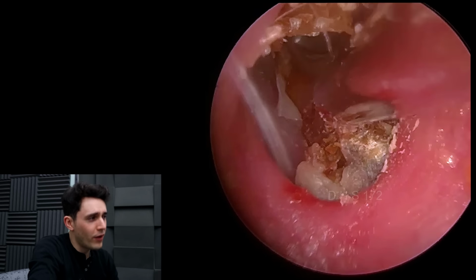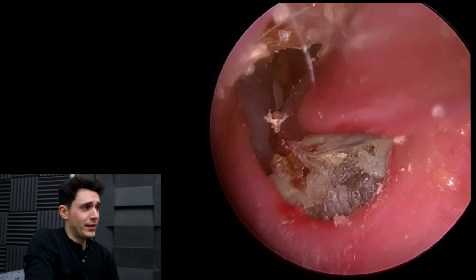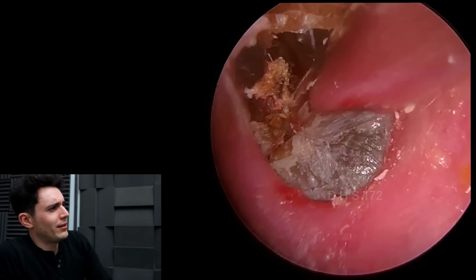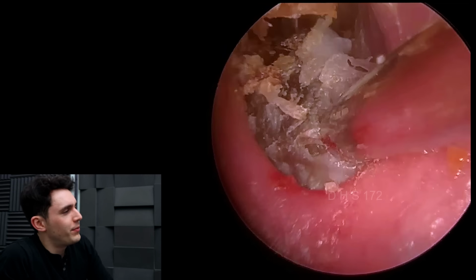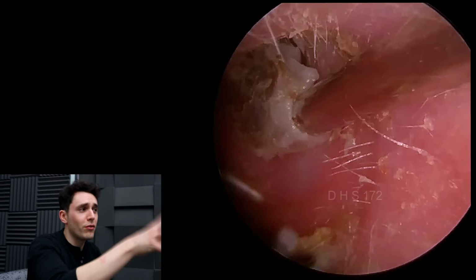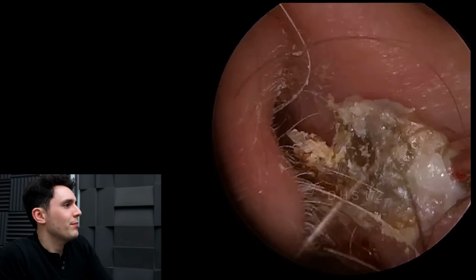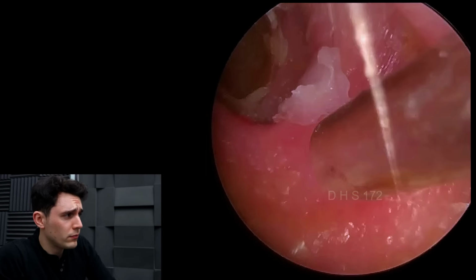Okay, so finally, I'm dragging this up with the suction, and we can now start to see this sort of iceberg emerging. And it's just way bigger than what we thought. That should not be there. In 3 months, that should not be there. But there it is. It's an absolutely insane amount of debris to accumulate in such a short amount of time.